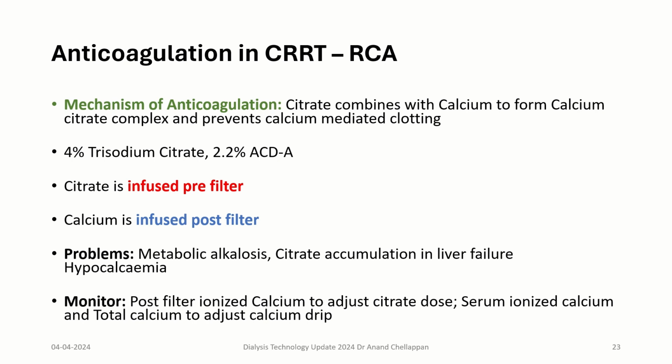Hypocalcemia can happen, the mechanism of which we just discussed. So, we should monitor the post-filter ionized calcium to adjust citrate dose. We should also measure the serum ionized calcium and the total calcium to adjust the calcium drip.